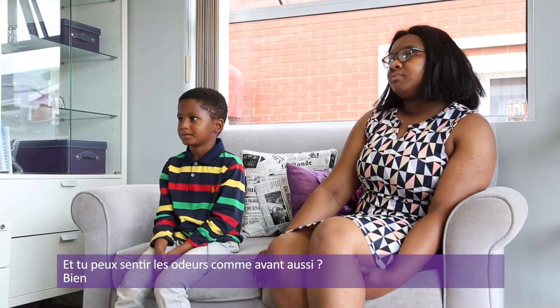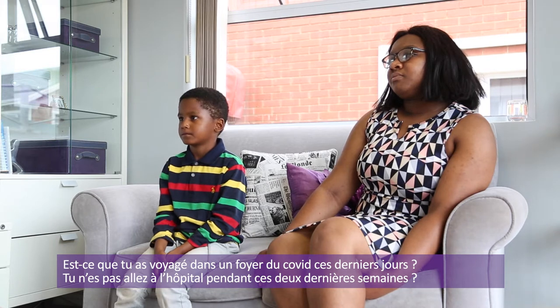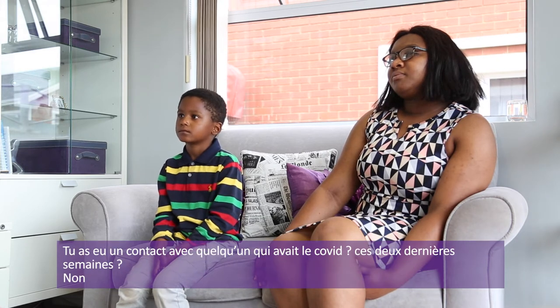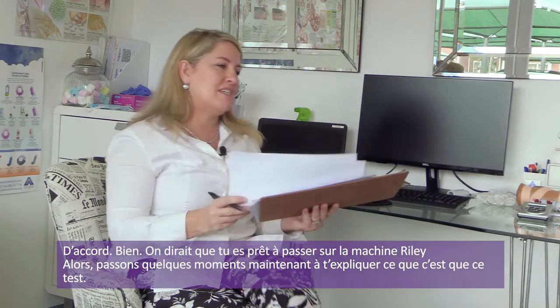Can you smell everything that you used to be able to smell? Good. Okay. Have you traveled to a COVID hotspot in the last 14 days? You haven't been to the hospital in the last 14 days? Been in contact with anybody with COVID in the last 14 days? No. All right, good. It's sounding like you're ready to go onto the machine, Riley.